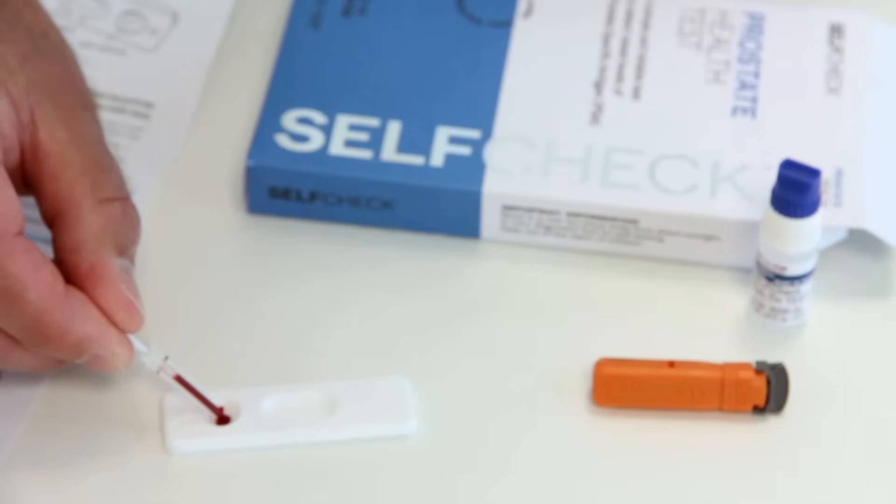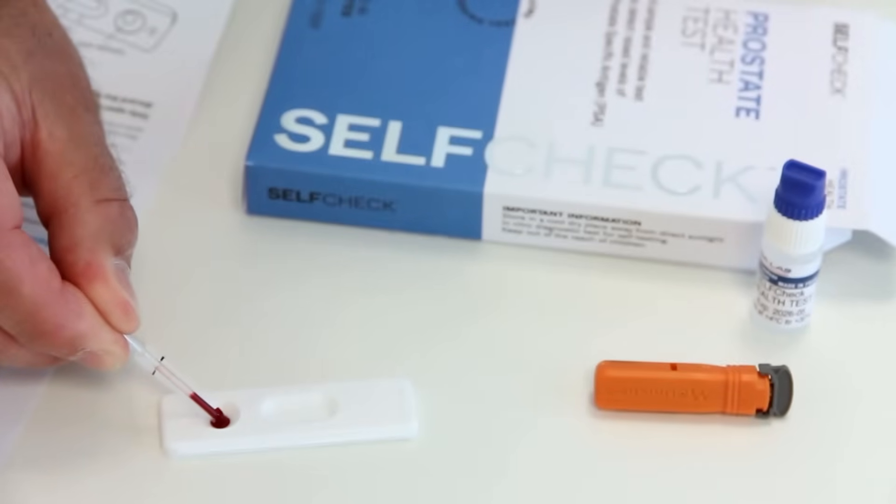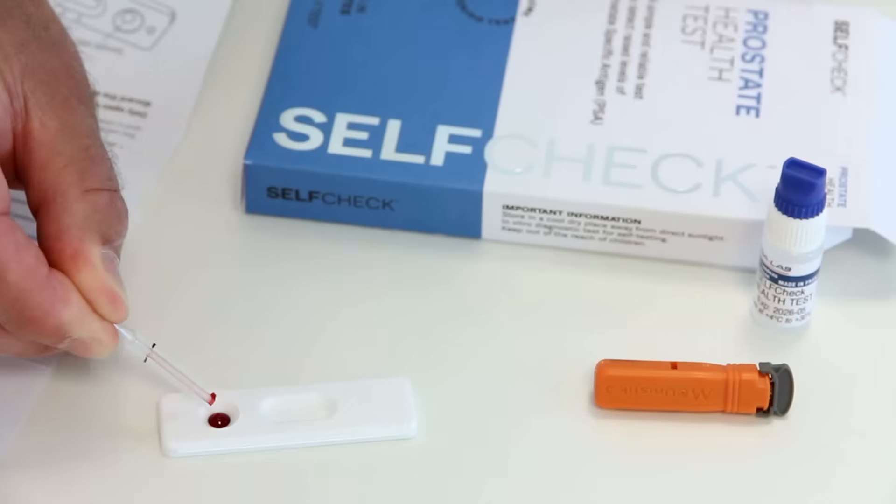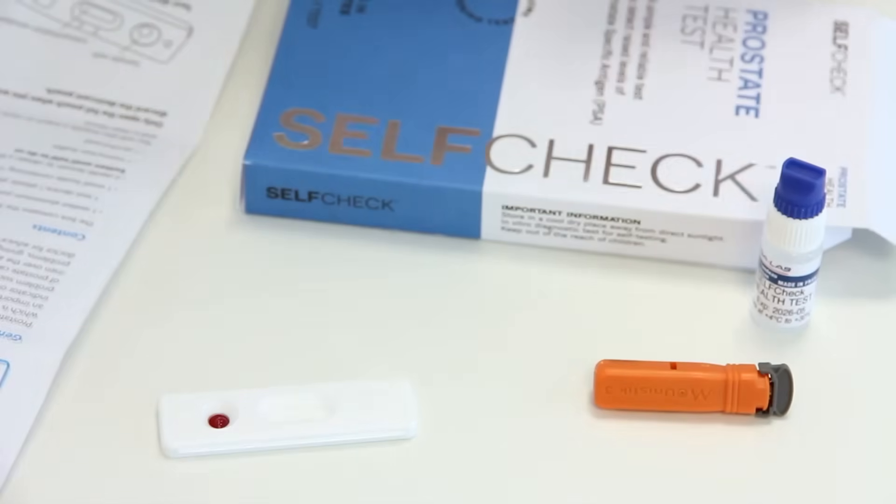Add the blood to the sample well of the test cassette by pressing the pipette bulb. Try to avoid air bubbles. Leave the blood to soak in for 30 to 40 seconds.